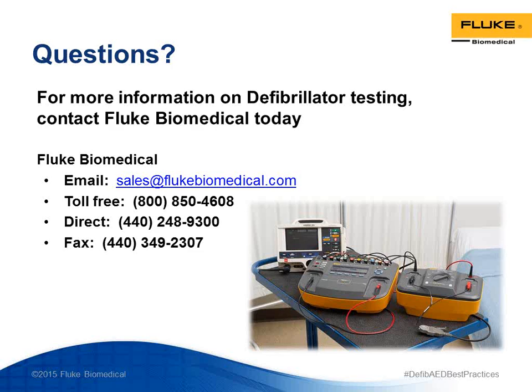We have quite a few questions, so if you don't mind, I'm just going to start with the very first one. How often should you calibrate the defibrillator? Great question. The manufacturer of the particular make or model of that defibrillator really determines the inspection frequency, including calibration. Here in the U.S., calibration means the act of adjusting the device to meet its manufacturer specifications. So you will find that defibrillators need to be inspected or calibrated about twice a year. Certainly they must be checked twice per year whether or not adjustments need to be made.